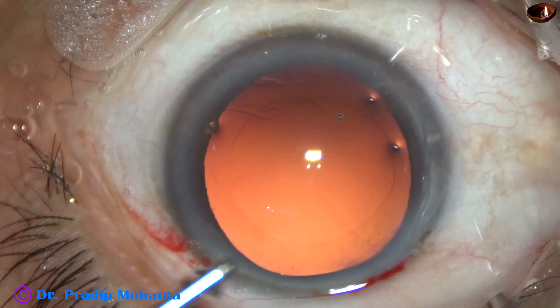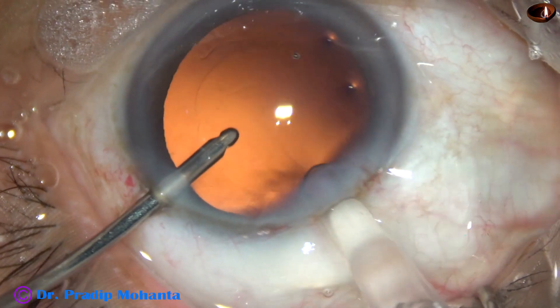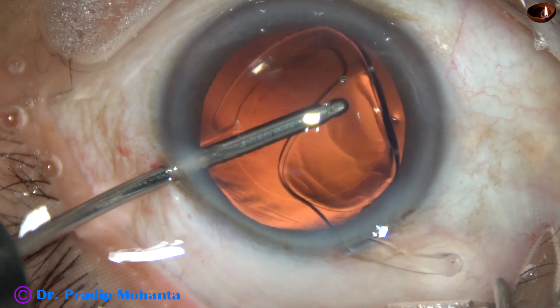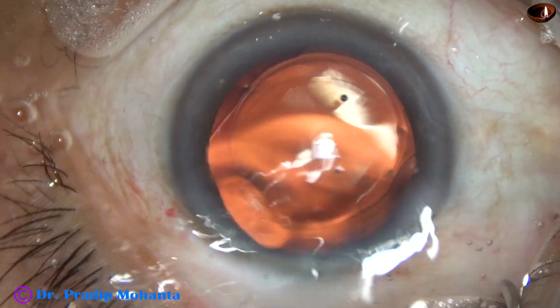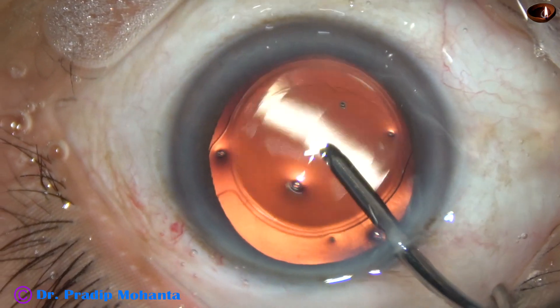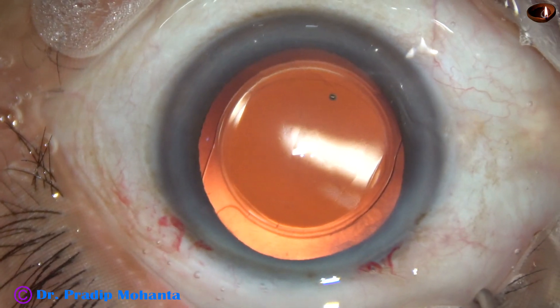And now this is hydro-implantation of a single-piece monofocal foldable intraocular lens. The lens goes into the capsular bag. The lens is dialed. Whatever amount of viscoelastic was there in the lumen of the cartridge is washed out.